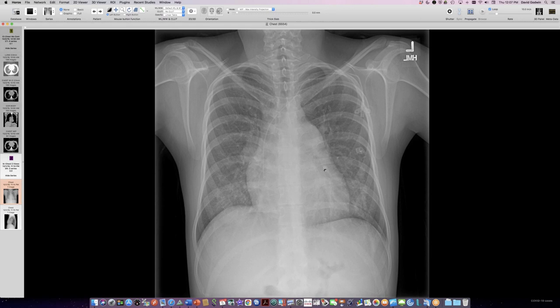Wow. Here's a young woman, 21 years old, with pulmonary hypertension. It's called idiopathic. We can see the main pulmonary arteries dilated. The interlobar right pulmonary artery is big. Heart's on the big side of normal. And intravenous catheter for therapy for this pulmonary hypertension is in place. And the lungs look kind of busy.